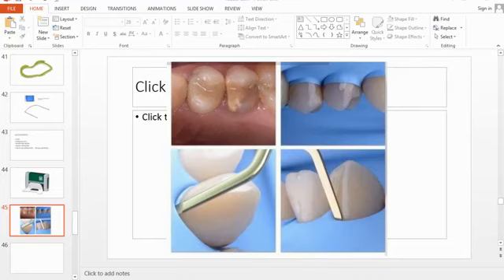Okay, and I'll tell you single tooth isolation, multiple tooth isolation, and you can start with single tooth isolation at least for endo, or I'll say start with your class also. तो इससे क्या होगा, कॉन्फिडेंस बूस्ट होने लग जाएगा यूज करने का.